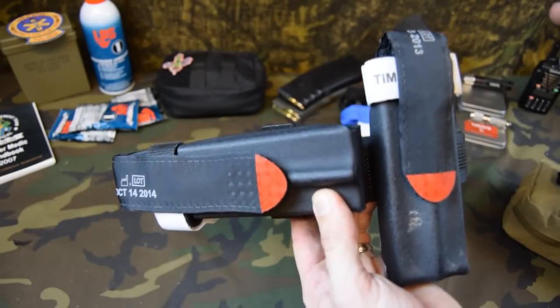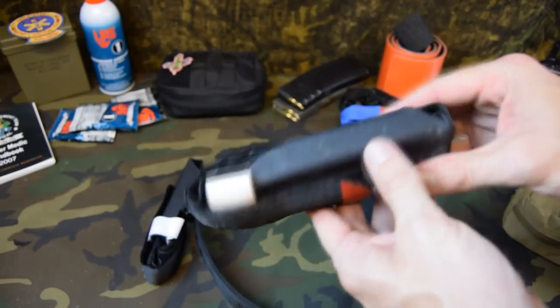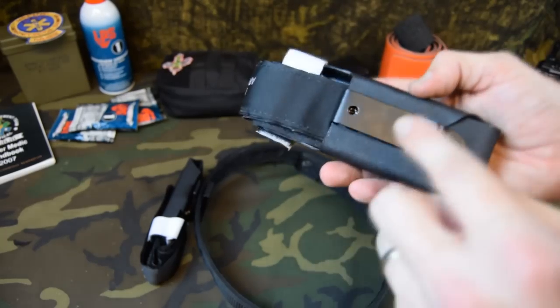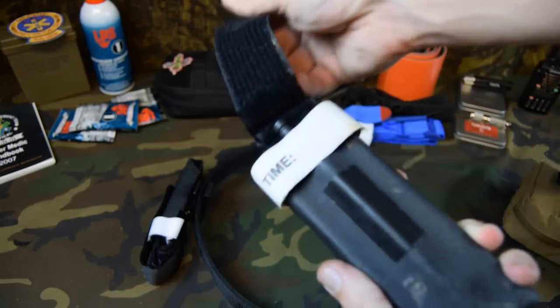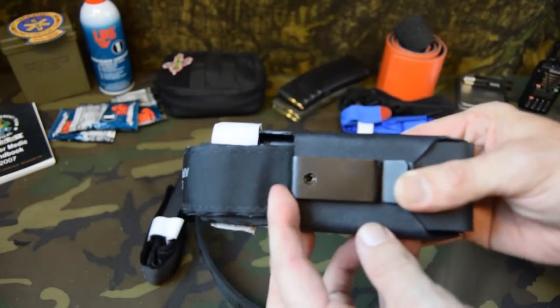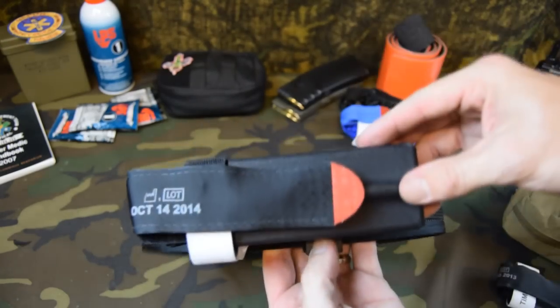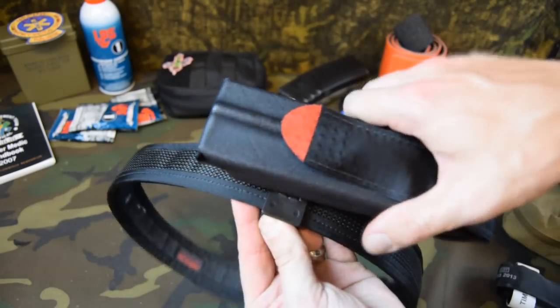The first two we'll look at are designed for a belt. This one is the first I came up with and it's actually still dirty from Fighting Pistol. This one hooks into a belt, doesn't rotate, doesn't move. You pull the red tab and your tourniquet comes out. This piece of Velcro here is going to keep it nice and secure to keep it from falling out. This clip here is designed to rotate so you can move your tourniquet however you want to keep it secure.